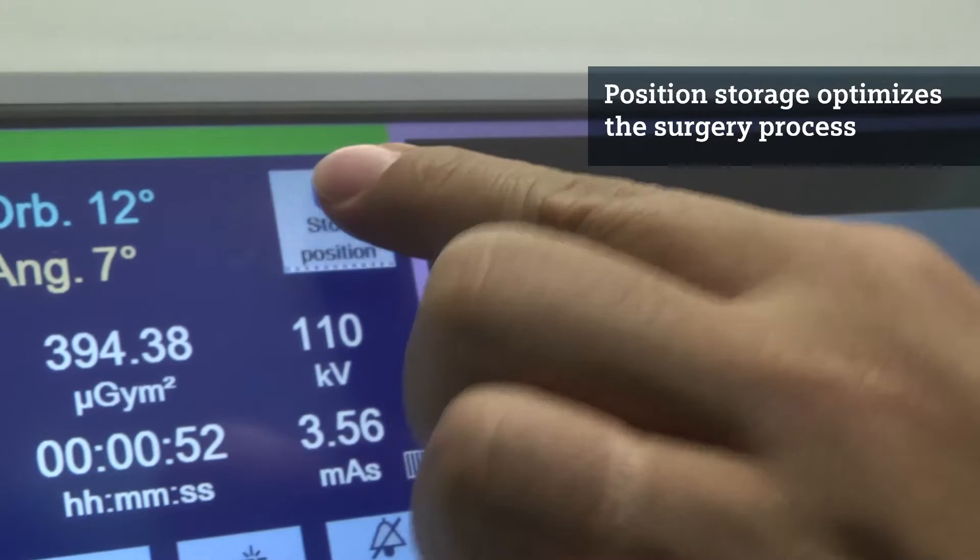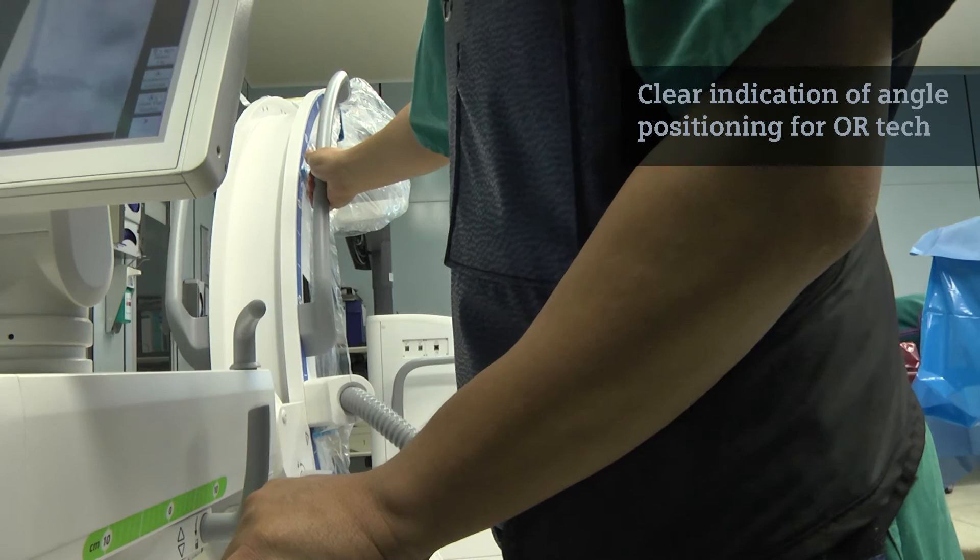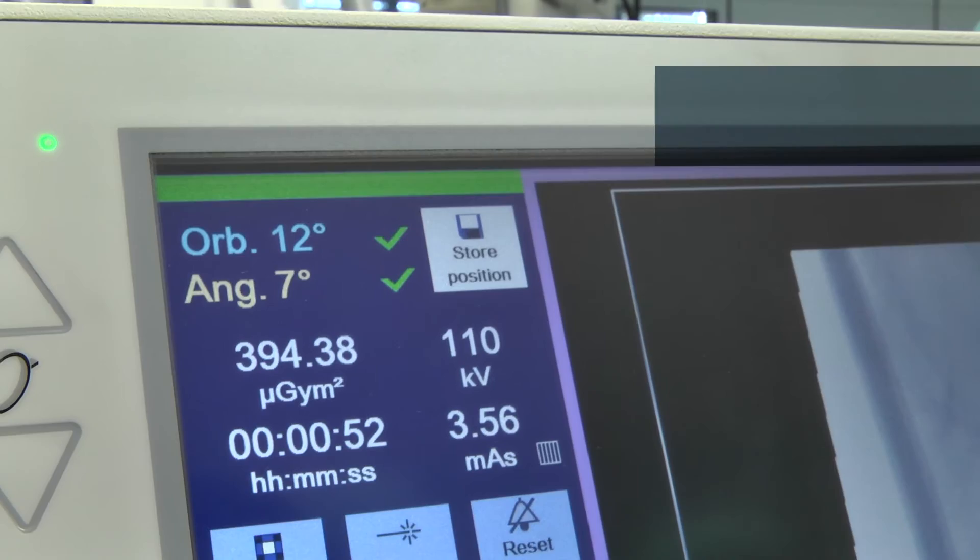Another feature to optimize the intraoperative process is the position storage device. If you have a projection and want to re-find that projection angle very precisely, fast, and straightforwardly, you can use the position storage device, and the OR technician can see exactly when the same projection has been reproduced.